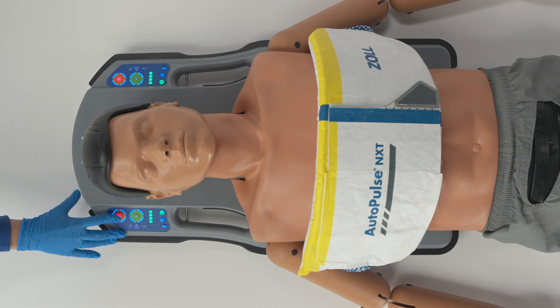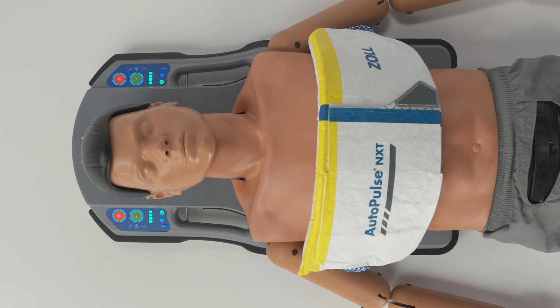To stop compressions, press the orange stop button a second time. If inactive for 15 minutes, the platform will automatically shut off.